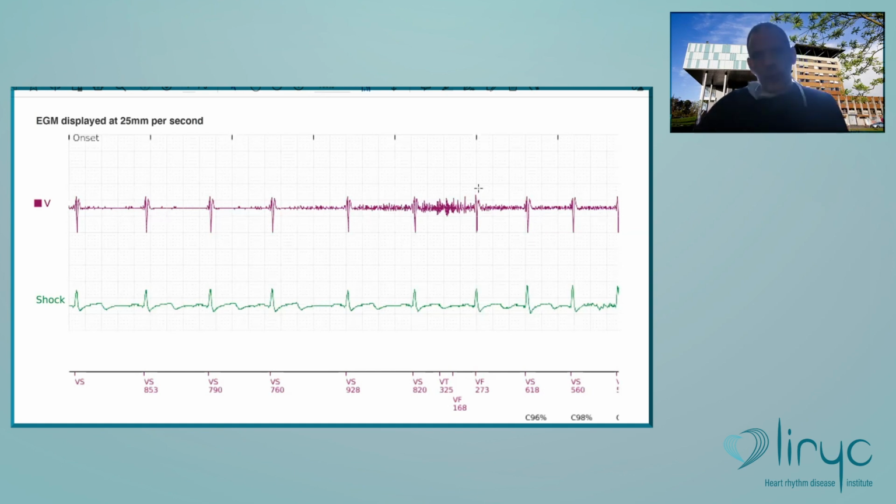In case of oversensing of diaphragmatic myopotential, the situation is different. Most of the time, it's a question of positioning of the lead. It's not a problem of lead dysfunction. The lead is sensing the signals because it has been positioned close to the diaphragm, and the risk is increased in Boston Scientific devices, because the risk is increased with pseudo-bipolar leads because of the distance between the tip of the lead and the coil.